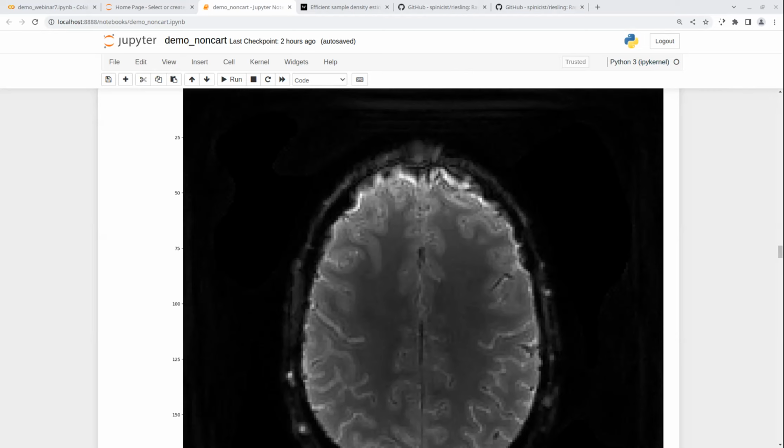I have a question about the flow imaging case. Because the sensitivity map is complex, if we are measuring a velocity curve, then I think we should only use one sensitivity map for all the different temporal frames. Is that right? I think so as well.